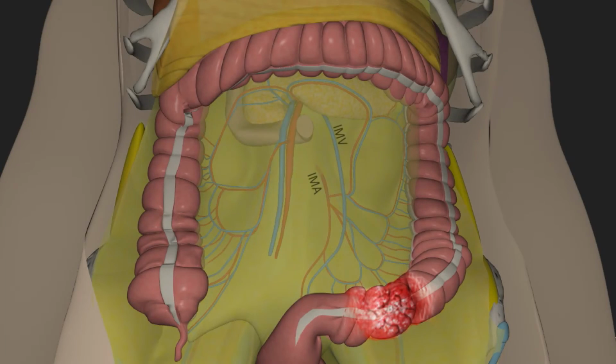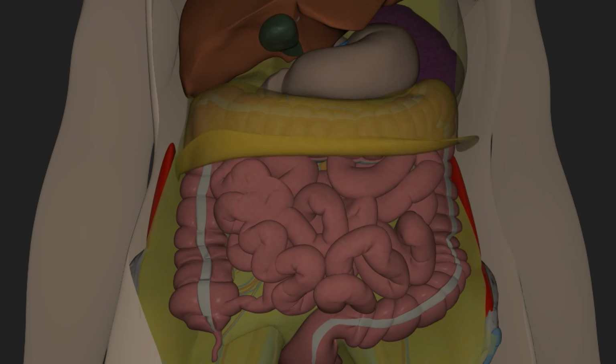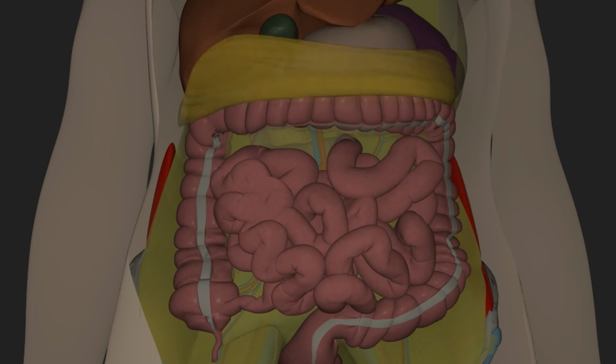Here, I will review the laparoscopic complete mesocolic excision for sigmoid colon carcinoma. The figure shows the resection margins for sigmoid colon cancer. The dissection planes are almost similar to the descending colon cancer, and full mobilization of the splenic flexure is also essential for a tension-free anastomosis in sigmoid cancer.